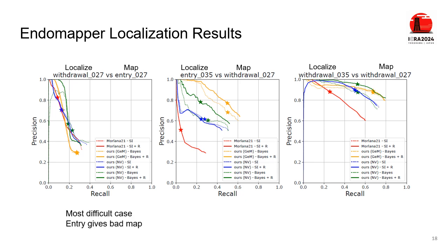In the first case, we observe that the entry map is not good enough to localize, as the doctors tend to go as fast as possible to reach the cecum, having less visibility than withdrawal stages. Our trained models and the Bayesian approach boost performance in the later cases, showing that place recognition is doable for second visits.